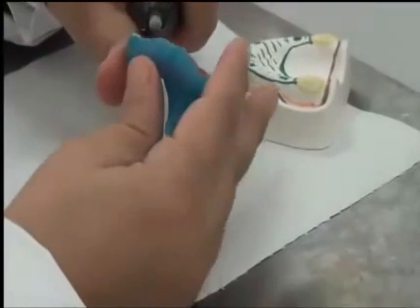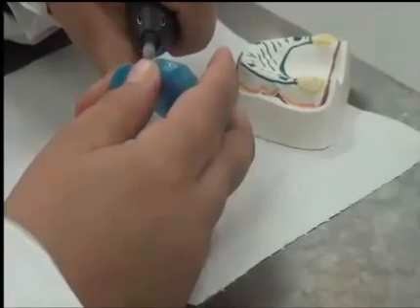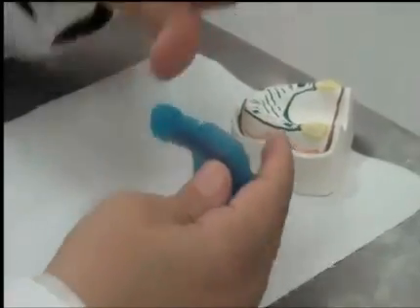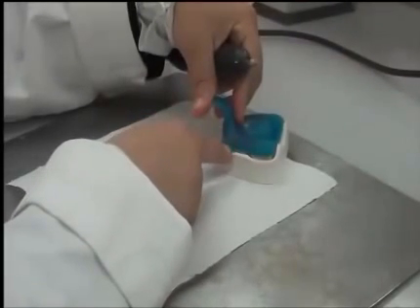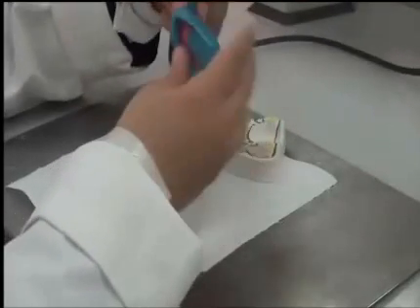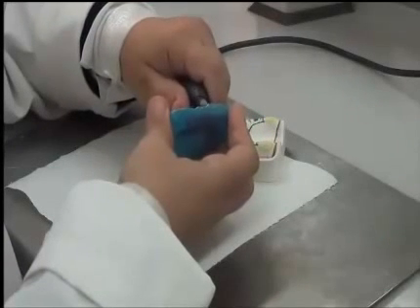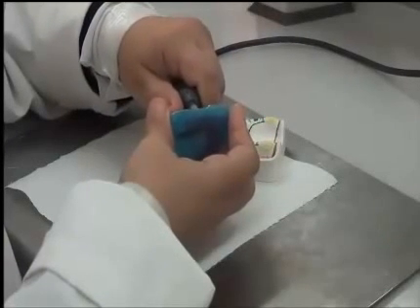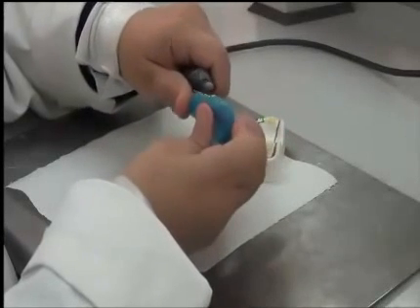In the areas where we have the frenum line, I open the notches. These are the areas where we have the frenum on the cast. If I place it now, you can see that for each frenum I should have a notch in the tray. So this is the frenum area, and this is the frenum area, so make sure that notches are clear in them.